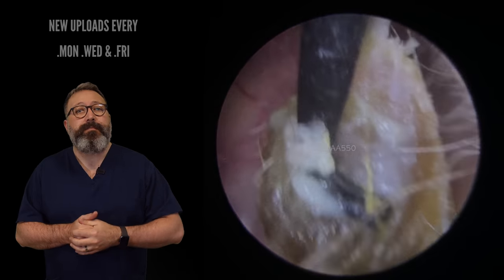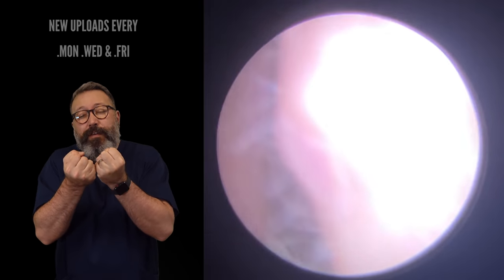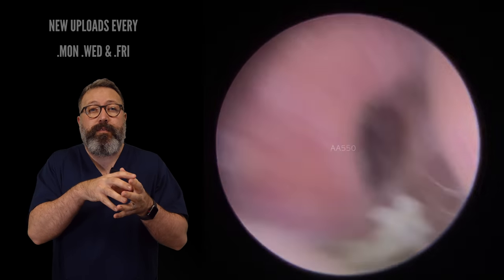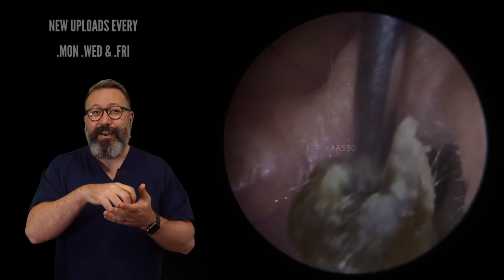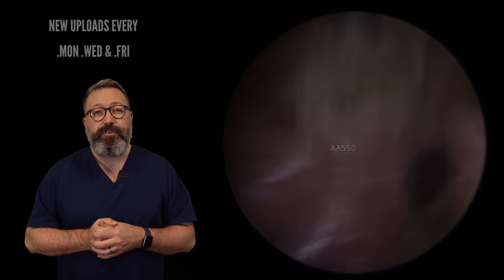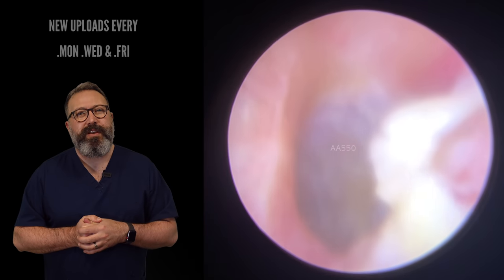So we've managed to get the St. Bart's hook behind it. You can see this white material here. This piece of wax is really, really tough as old boots. It's hard old stuff and it's anchored against the side of the ear canal from this little bit of dry skin. So I couldn't get the St. Bart's hook in — it was that tough to lift it up in front of the camera. So we've had to use the suction tube here. Let's take a look behind there. You'll see that little stretch of dry skin here.